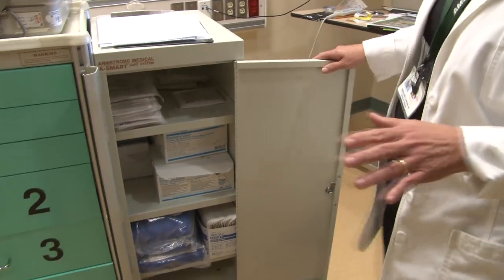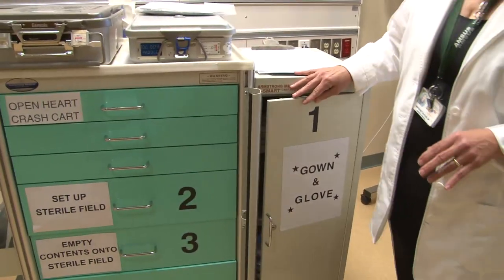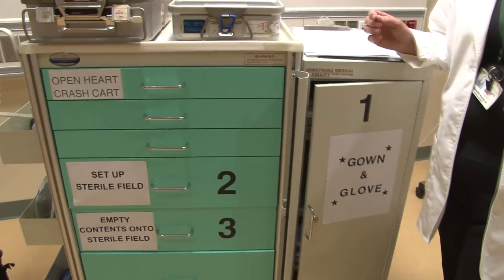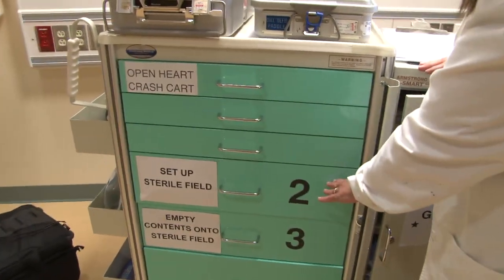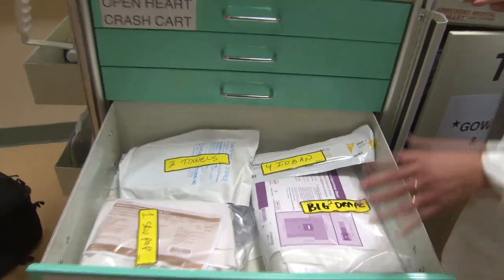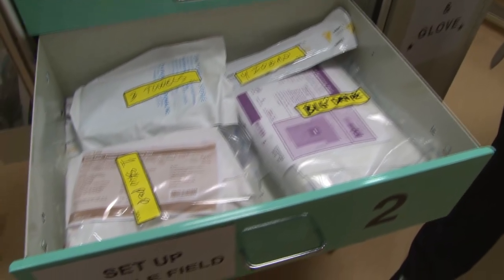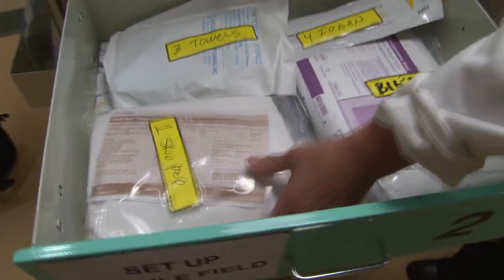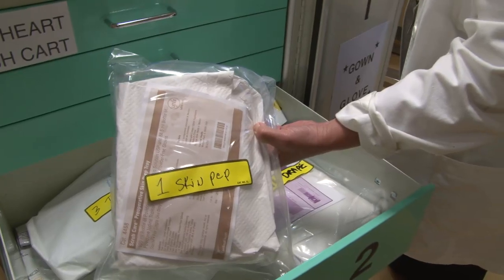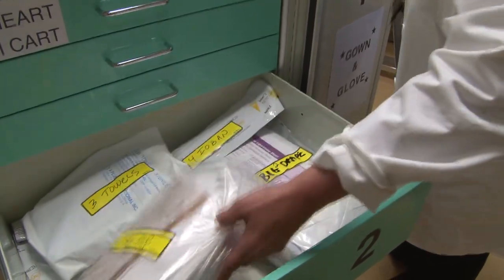The first thing you'll do is open drawer number one: gown and glove. The surgeon will tell you what size. The surgeon and the assistant will each become sterile as we gown and glove them. The other people in the room just need to wear a mask. Once they are gowned and gloved, you need to set up the sterile field. Go to drawer number two, set up the sterile field. Every item in here has a number on it — that's the sequence that you hand them over to the surgeon and his assistant. The first thing you want to hand them is the skin prep kit.